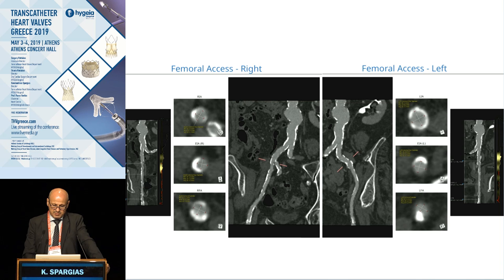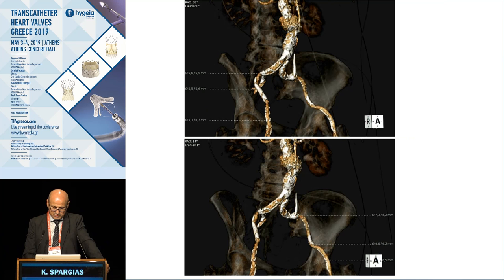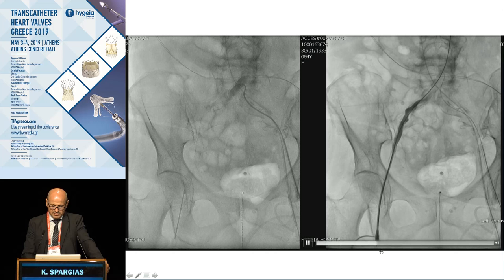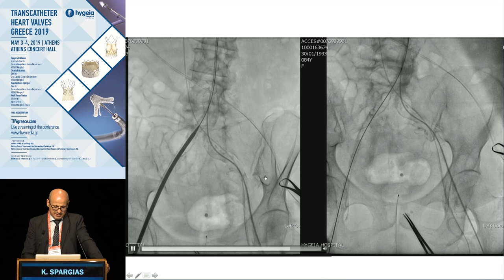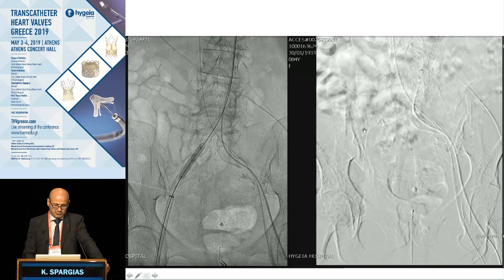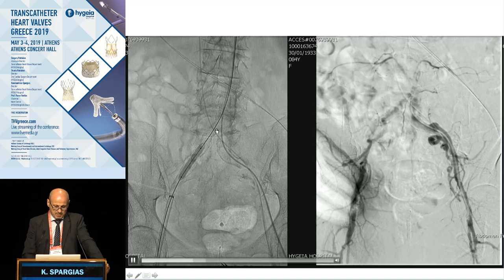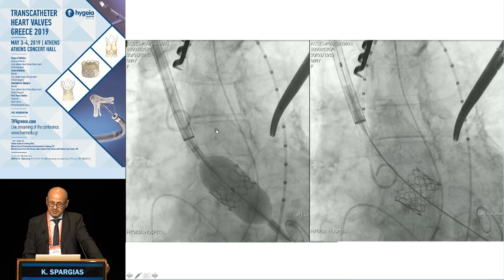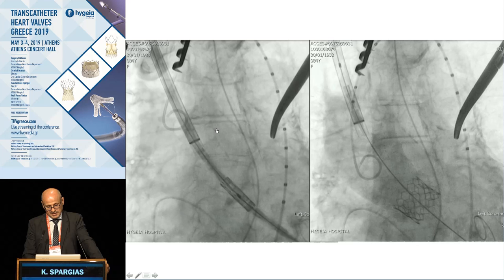This patient had an abdominal aneurysm, small diameters, and a lot of calcification in the peripheral arteries. We could appreciate all these problems at the beginning of the procedure. We did pre-dilation initially with a 12-French dilator. There was a stenosis preventing us from advancing the 14-French E-sheath, so we performed balloon dilation there. Despite balloon dilation, we were still not able to get in. We converted to transaortic implantation of a Sapien valve, and at the end everything was fine.